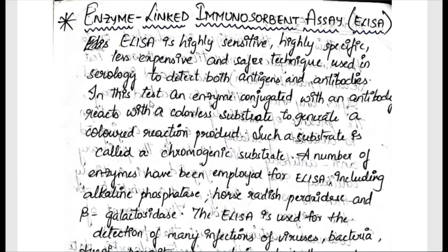In this test, an enzyme conjugated with an antibody reacts with a colorless substrate to generate a color reaction product. In the previous part, we discussed that if we use a radioactive substance, then we name it a radioimmunoassay. If we use fluorochrome dyes, then we call it immunofluorescence, isn't it? In the same manner, in this ELISA technique, we take an enzyme which is conjugated with an antibody and reacts with the colorless substrate to generate a color reaction product. Such a substrate is called a chromogenic substrate.